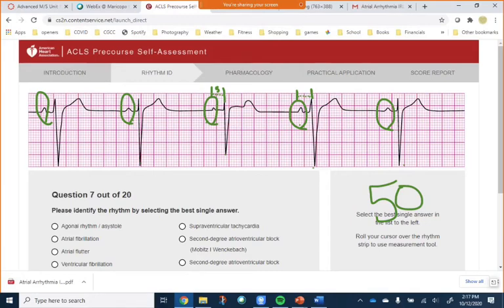This one's starting in between this one and going to here. 1, 2, 3, 4, 5. So they're all pretty even. I'm kind of varying on where I'm starting these. This one goes here to here. They're not full boxes. 1, 2, 3, 4, 5. They're all about 5.5 boxes.